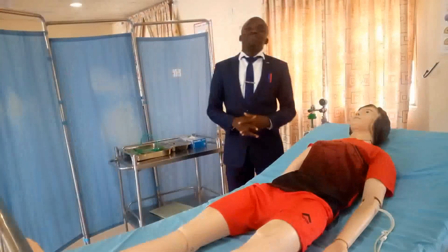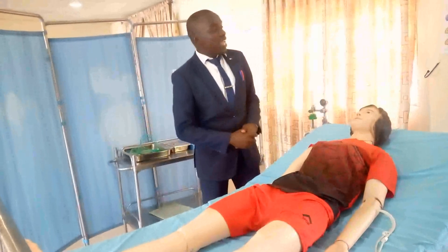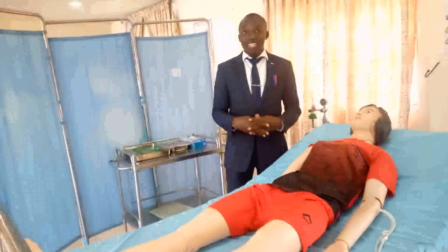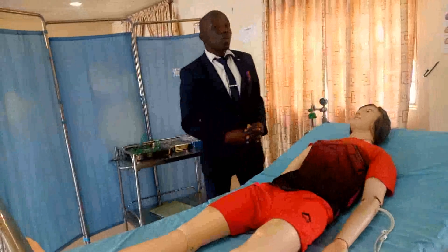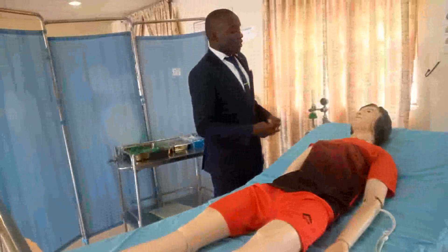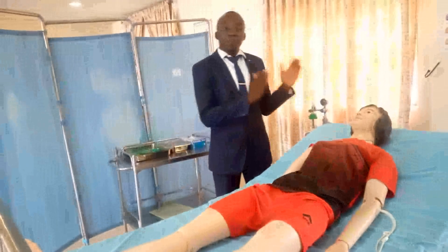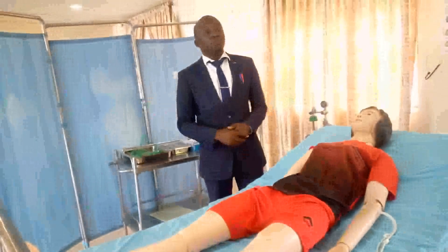Good morning. I am Nassali Wu. Today I am going to demonstrate how to administer oxygen during an OSCE examination. When you are asked to administer oxygen to a patient during an OSCE examination, you have to divide the procedure into three parts: the preparative phase, the procedure, and the finishing phase.